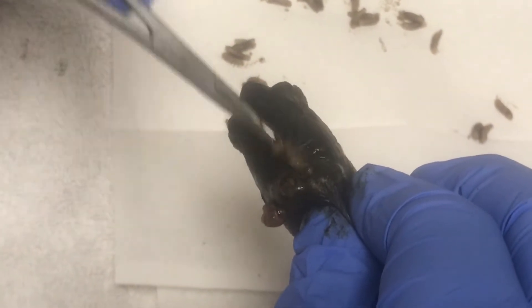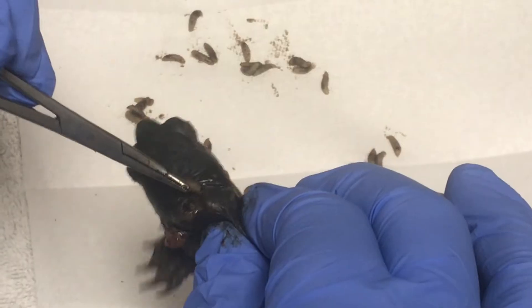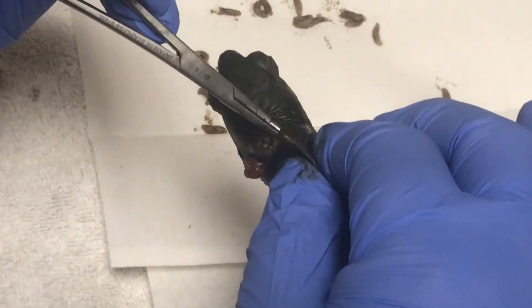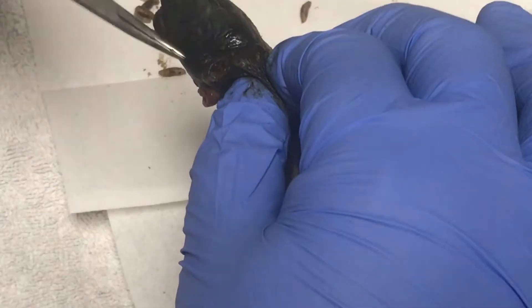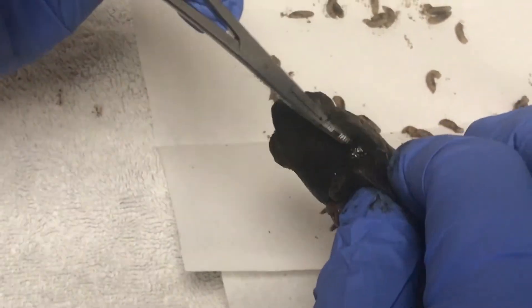More maggots. They keep coming. Another one. Give me this hole — I think I see some more. They just keep coming. Two at a time. The smell, the smell, the smell. Another one. I want another one. I'm going to grow these — I'm going to be a daddy.